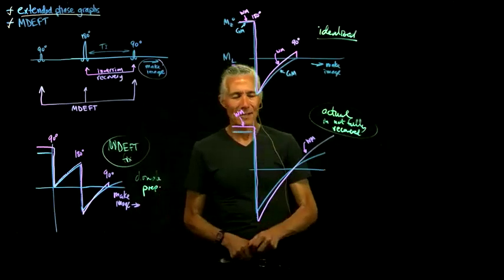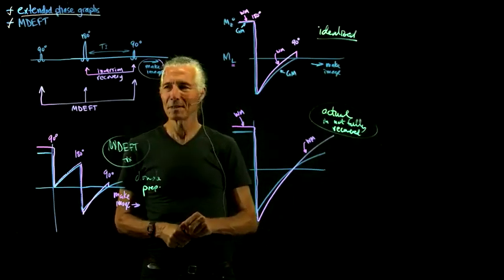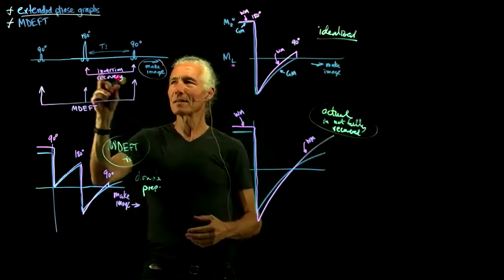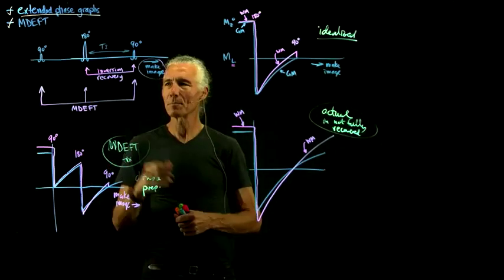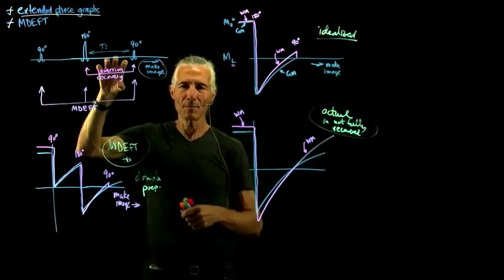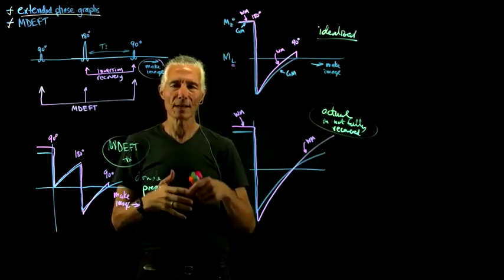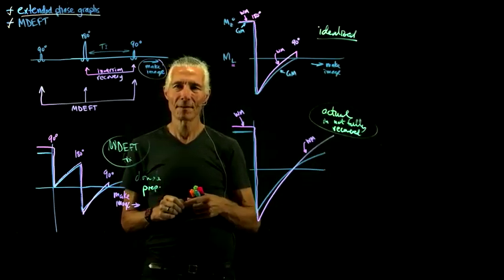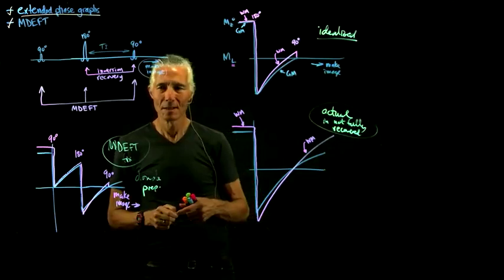Okay, so I think that one was also a little clearer than you asked last year. So any questions about two preparation pulses instead of just one? Both of these kinds of things are commonly used, especially inversion recovery or something like inversion recovery. We'll talk about MP-RAGE. It's the most commonly used structural sequence for looking at T1, gray matter and white matter. So any questions? All good? Yeah.